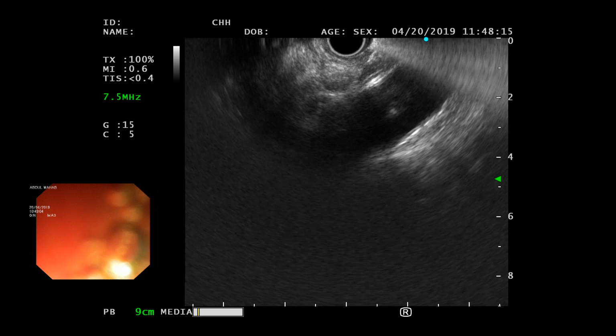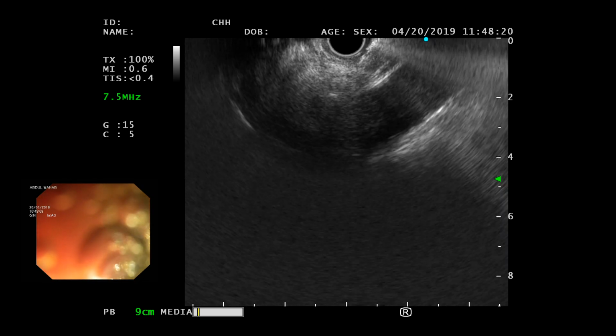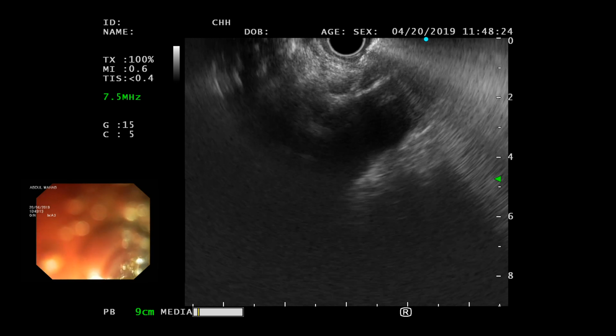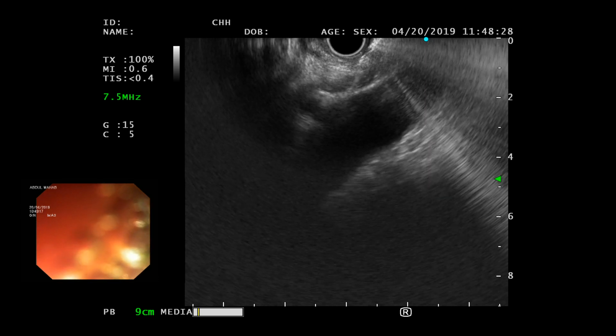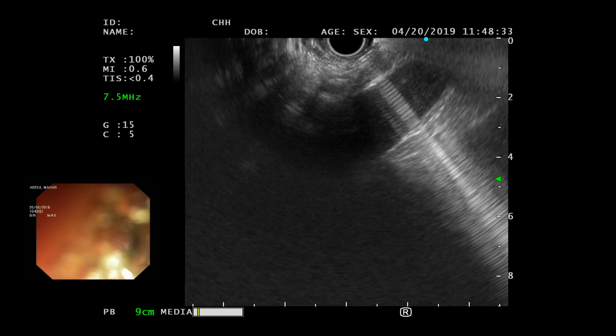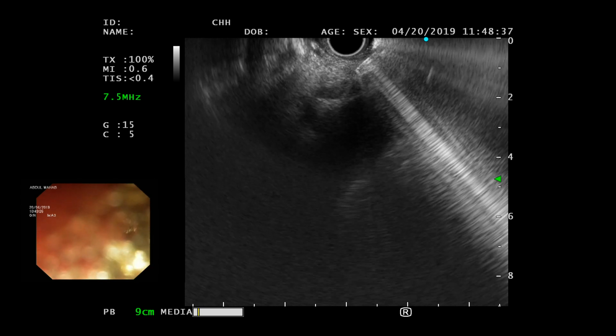And secondly, can you see the needle coming out there? Yes. So the ganglion shows as hypoechoic areas. Normally you don't see them, to be honest. And right below is the artery, right below is the artery. Okay. So you just need to keep that artery in picture.